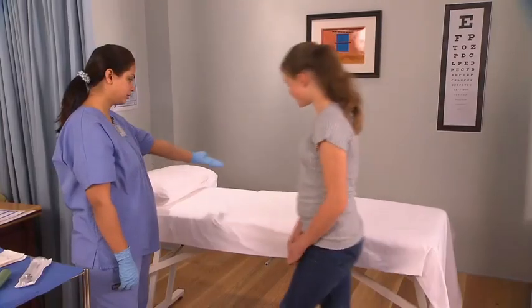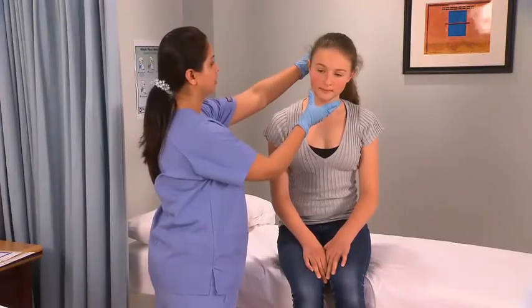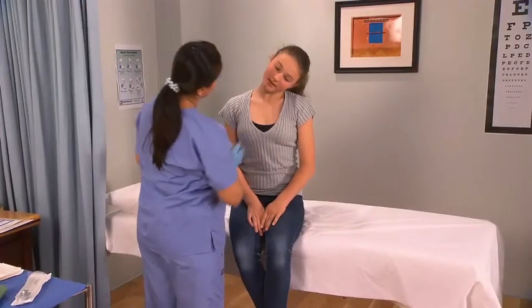Guide the patient into a sitting position. To irrigate the ear, tilt the patient's head down towards the affected ear. To instill the ear medication, turn the patient's head to the other side so that the affected ear is facing upwards. The supine position may also be used with the head positioned similarly.